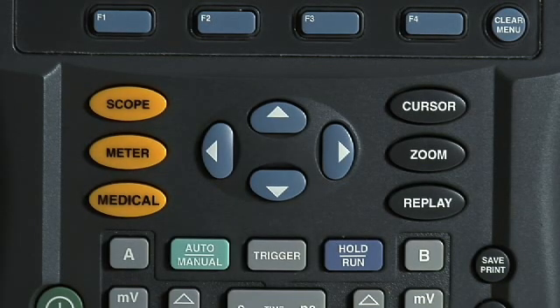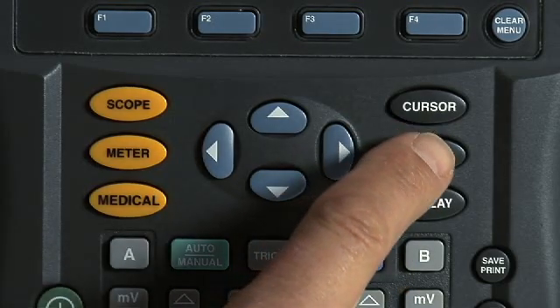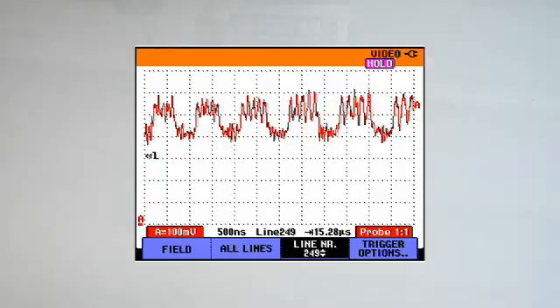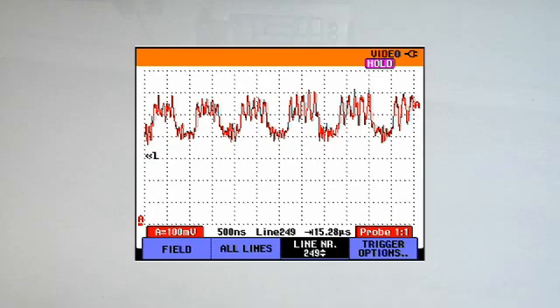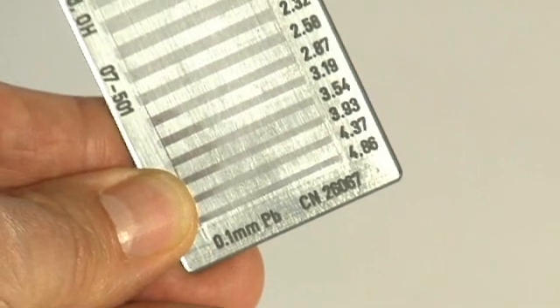The zoomed image shows each section of the scanned resolution test pattern more clearly and allows the operator to determine the resolution level that can be seen most clearly.